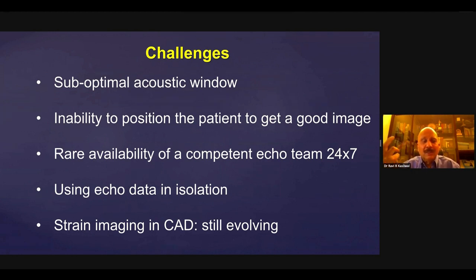But what are the challenges? Everything is not hunky-dory. Whenever you look at a technique which is very, very good or something which you've used for years, just see. Sometimes there may be a suboptimal acoustic window. After all, a person who's sick, you may not be able to position him clearly to actually get a good window. And then in many labs, in many hospitals, you may not get a good echo 24/7, but that's what the patient needs. And don't use the echo data in isolation.